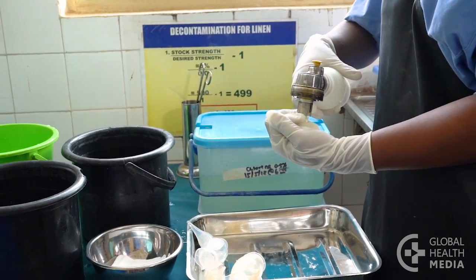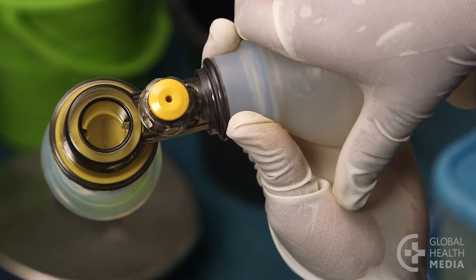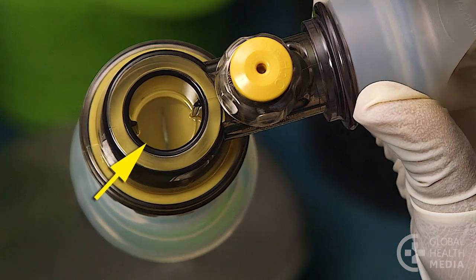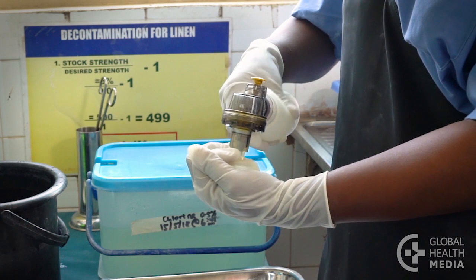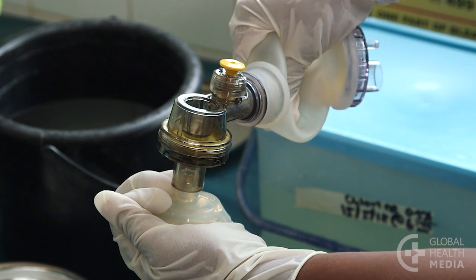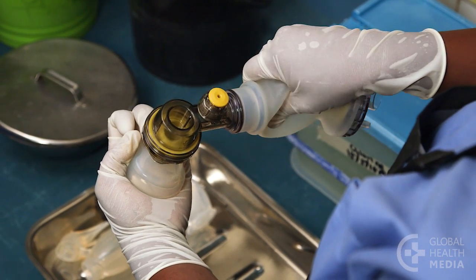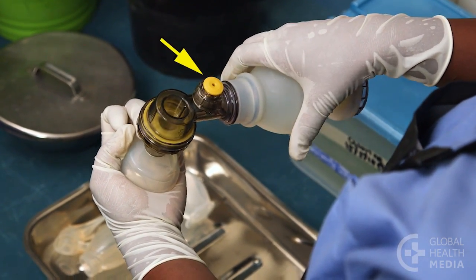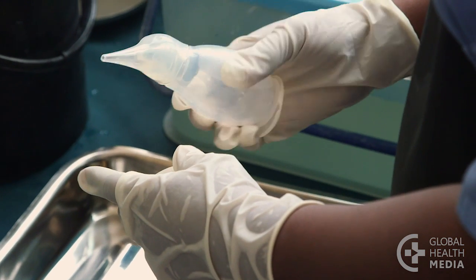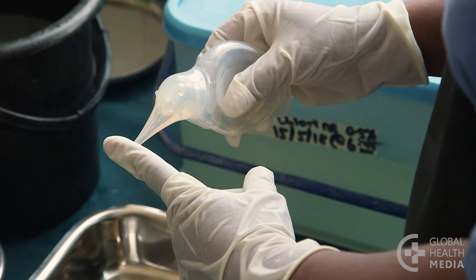Now, test that the equipment is working well. First, squeeze the bag and watch for the valve to open and close. Next, make a seal with your palm and squeeze the bag. You should feel pressure against your hand. See the bag re-inflate and hear air escaping from the pop-off valve. Then test the suction device. Squeeze it, block the tip and release. It should not expand until the tip is free.